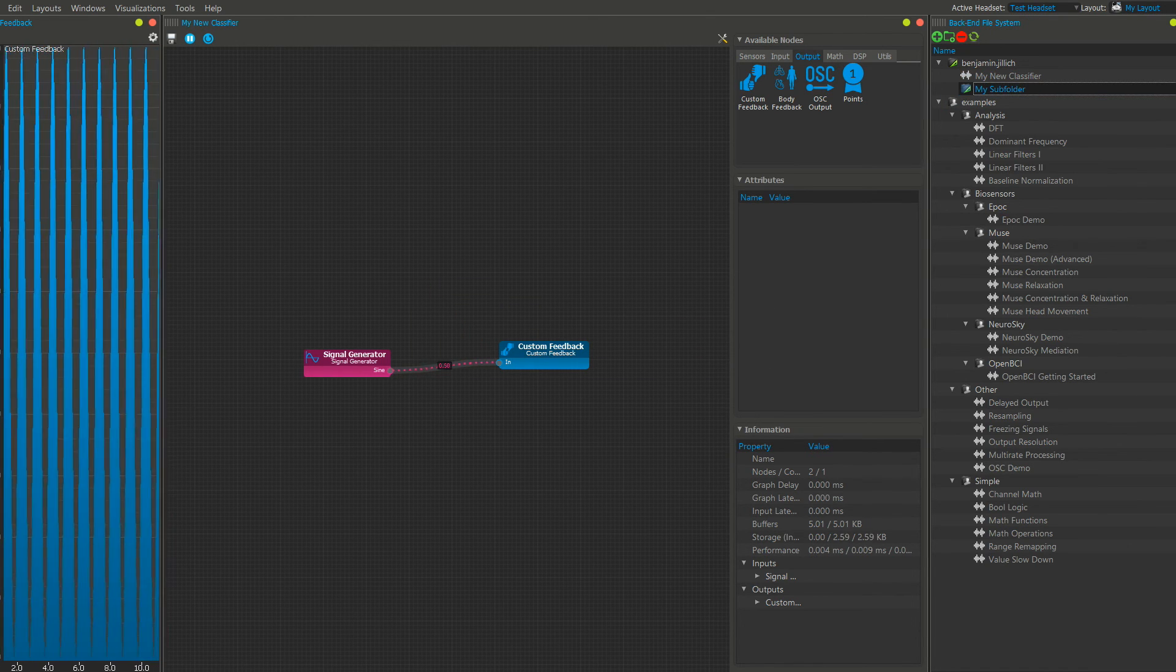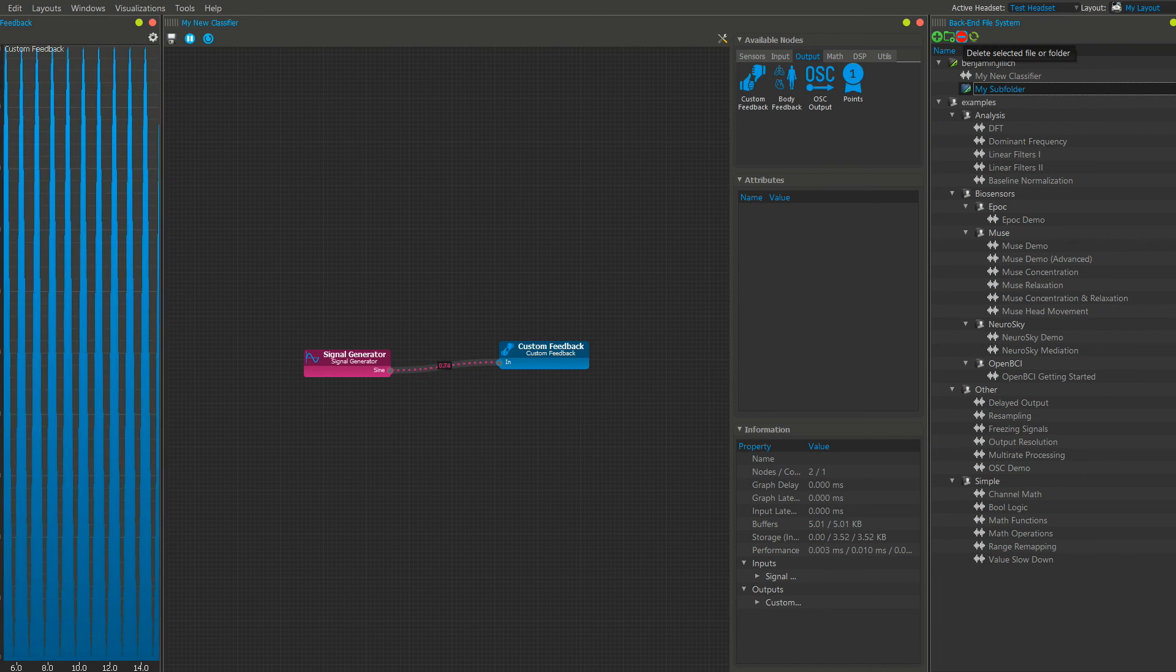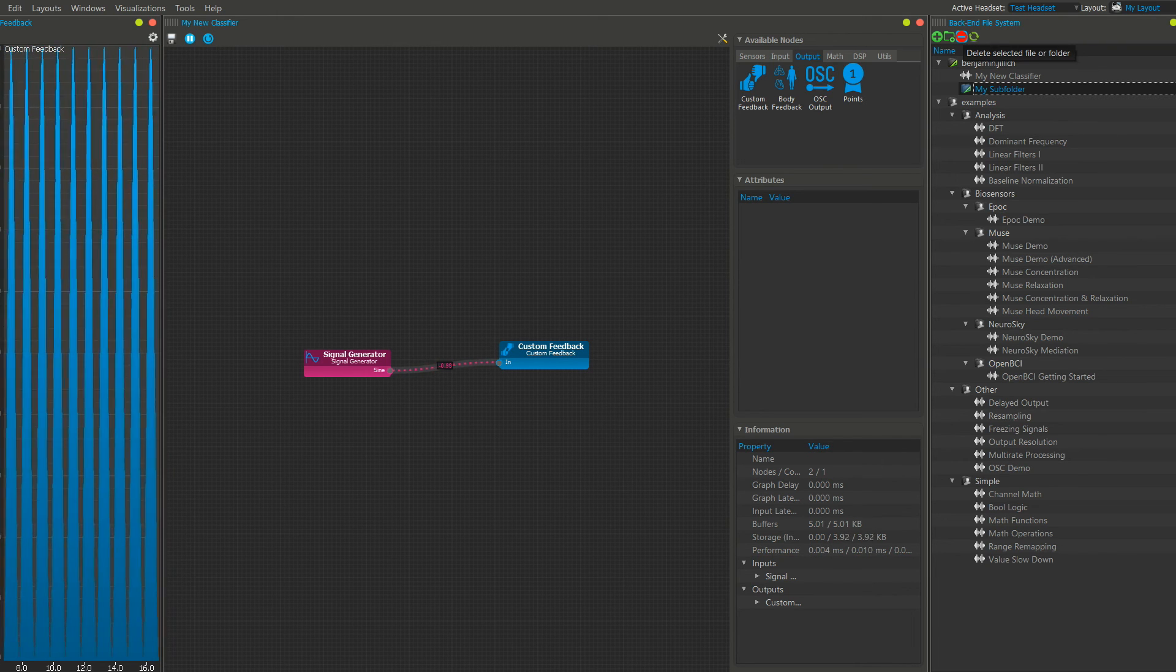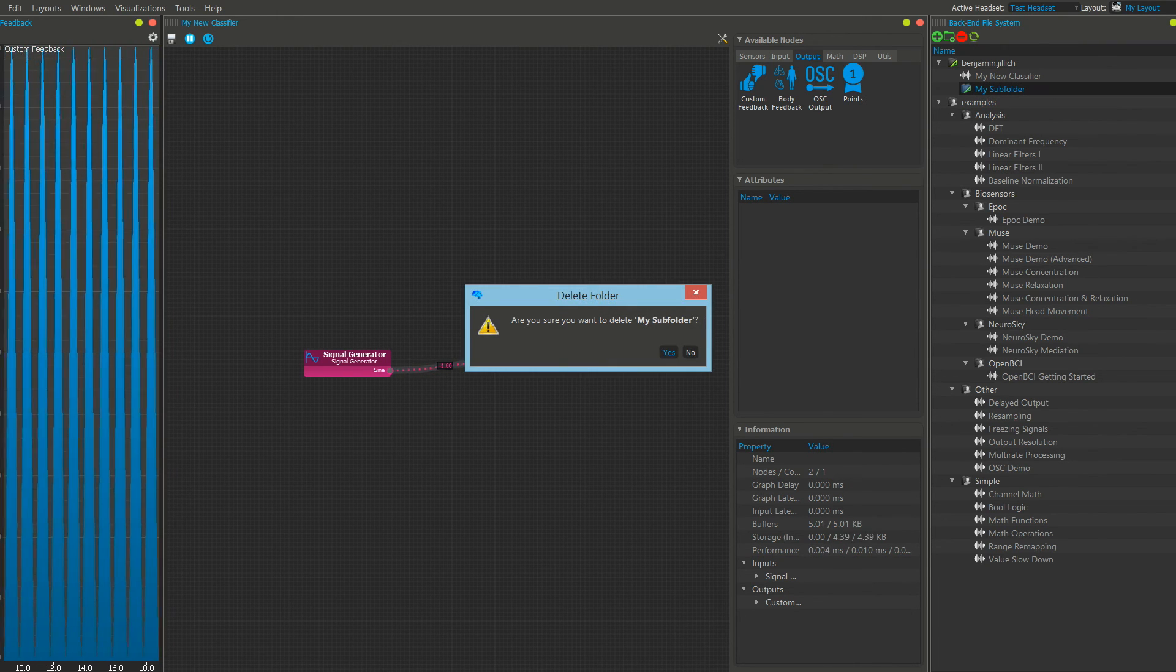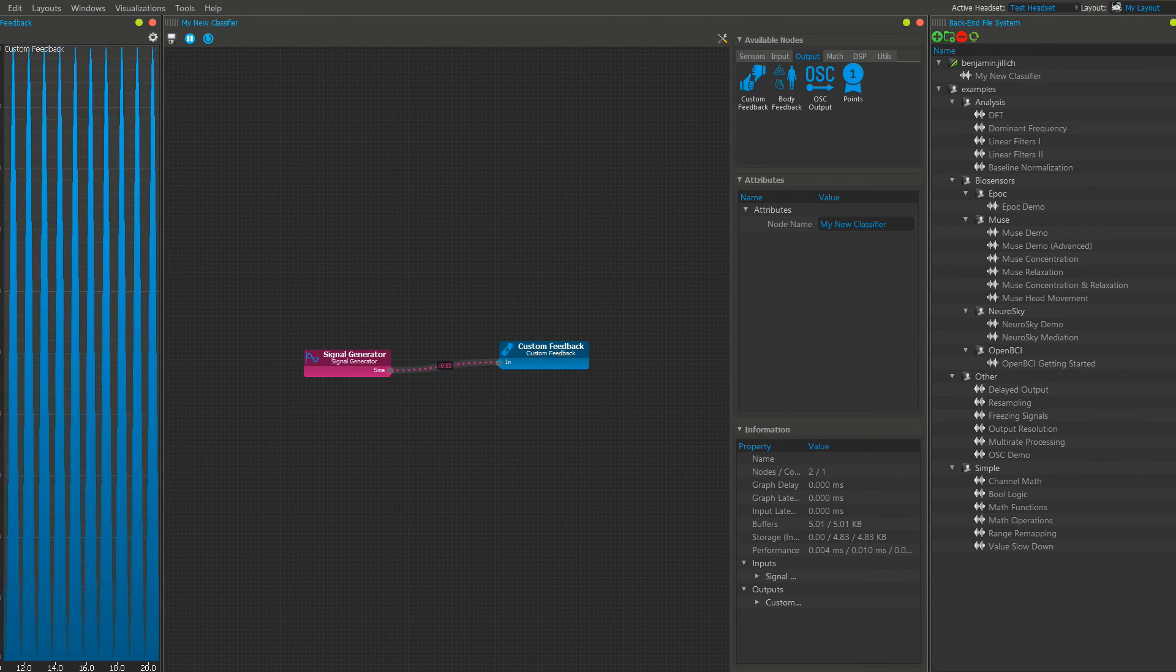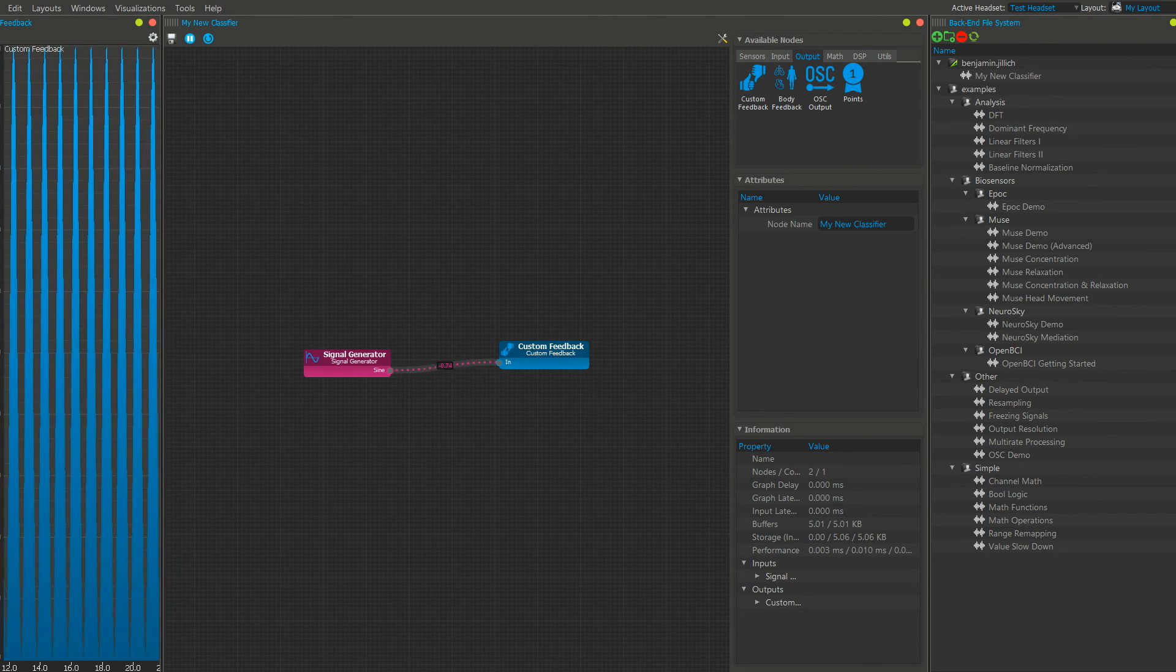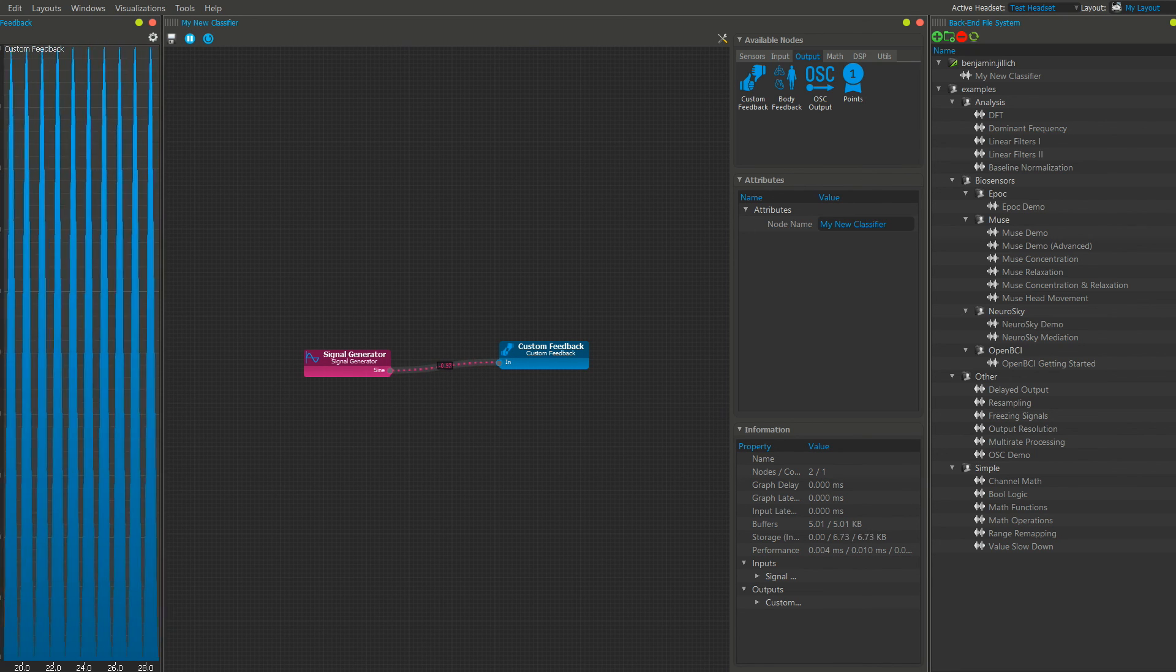Subfolders as well as classifiers can be removed with the remove icon. Please note that everything inside the folder is going to be removed along with the folder.